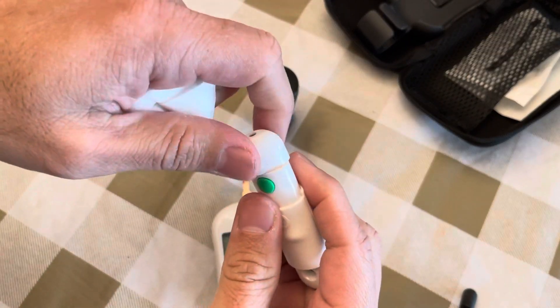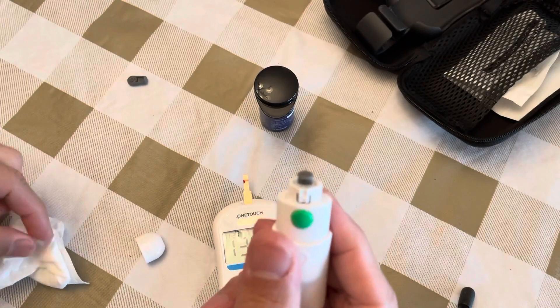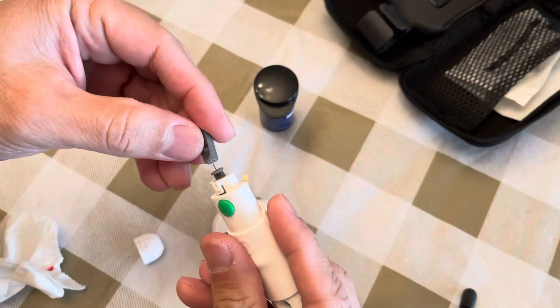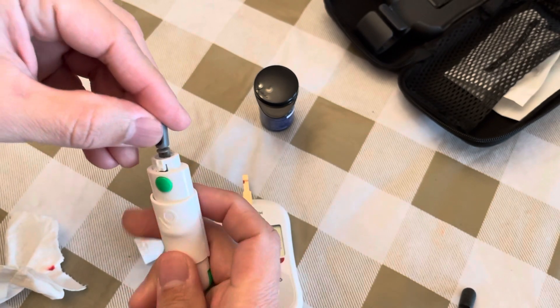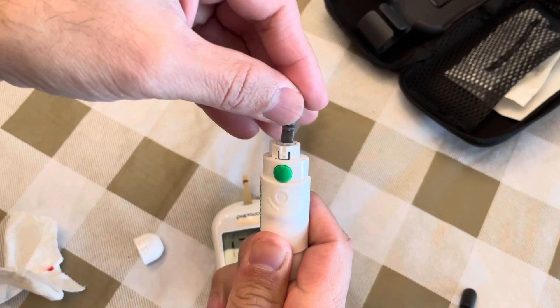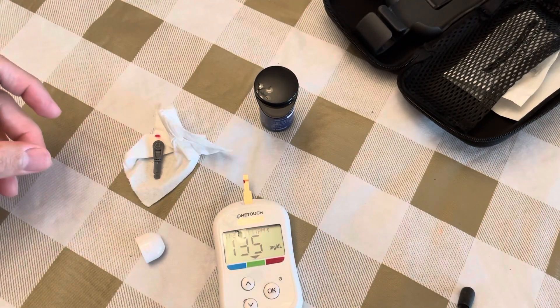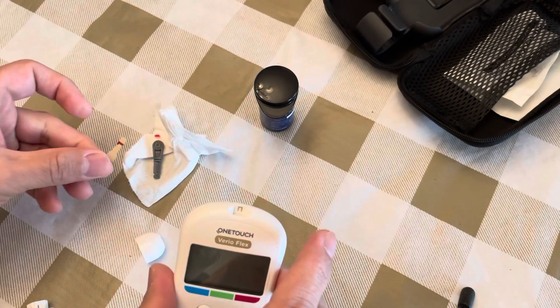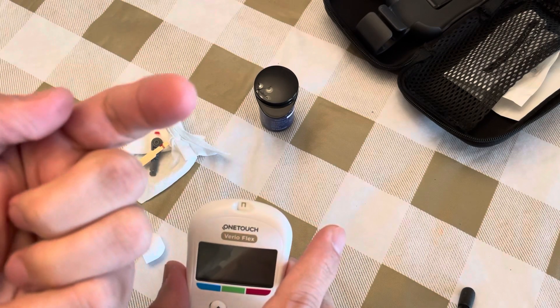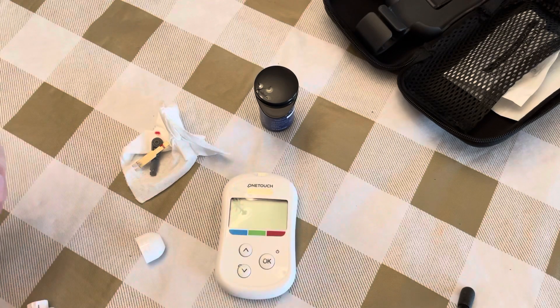Next, remove the needle and the strip — both are single-use and need to be discarded. Push the needle out and discard it along with the used strip. Make sure to wash your hands before and after the test. Let me know in the comments if this was helpful. Thanks!